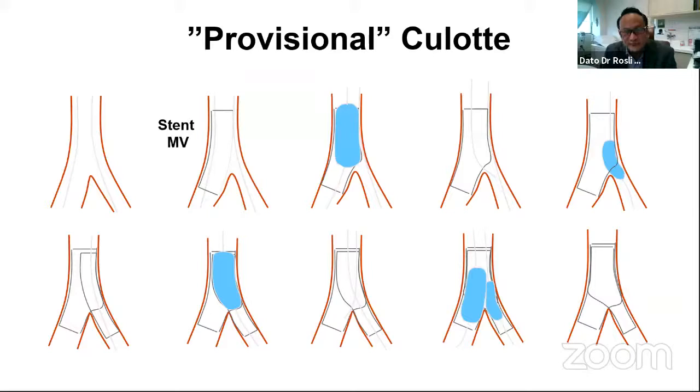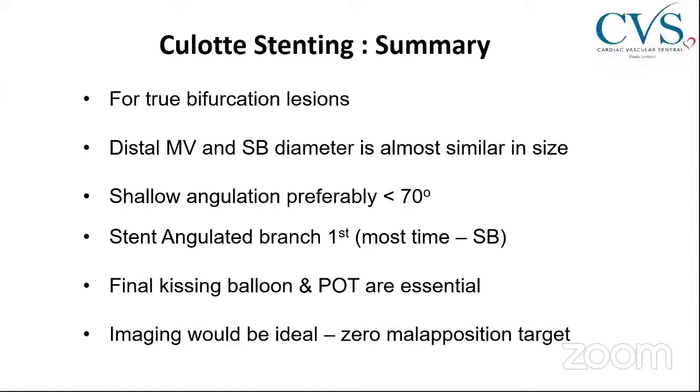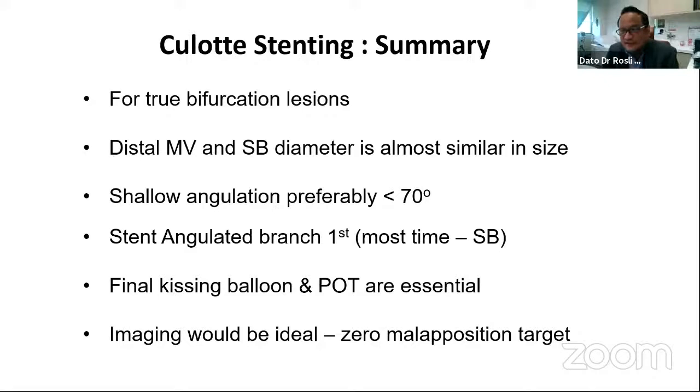So to summarize, the culotte stenting is meant for true bifurcation lesions, where the distal main vessel and the side branch are almost similar in diameter, and the angulation is fairly shallow, probably less than 70 degrees. If you stent in the classical culotte, you should stent the angulated vessel first, and in most cases this is the side branch. Remember, final kissing balloon and POT are essential. Imaging would be ideal because you are aiming for a zero malapposition target. So thank you very much for the kind attention.